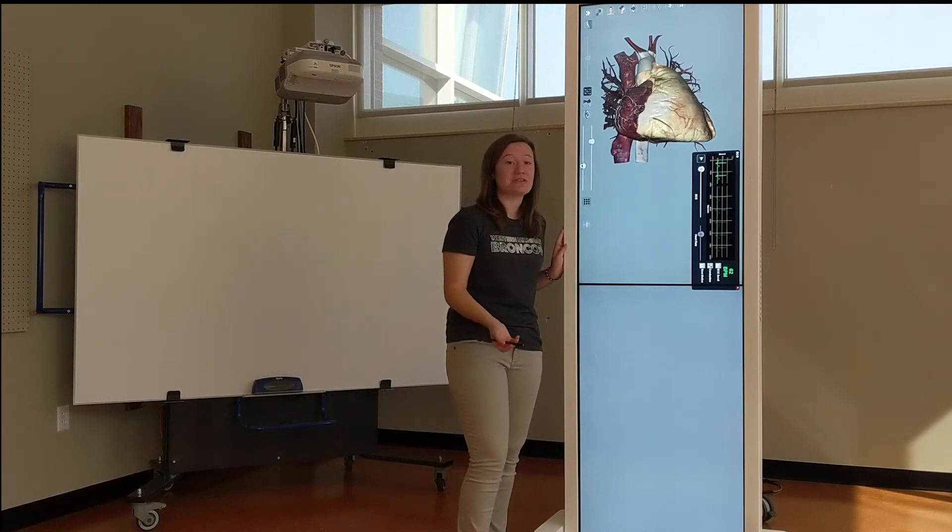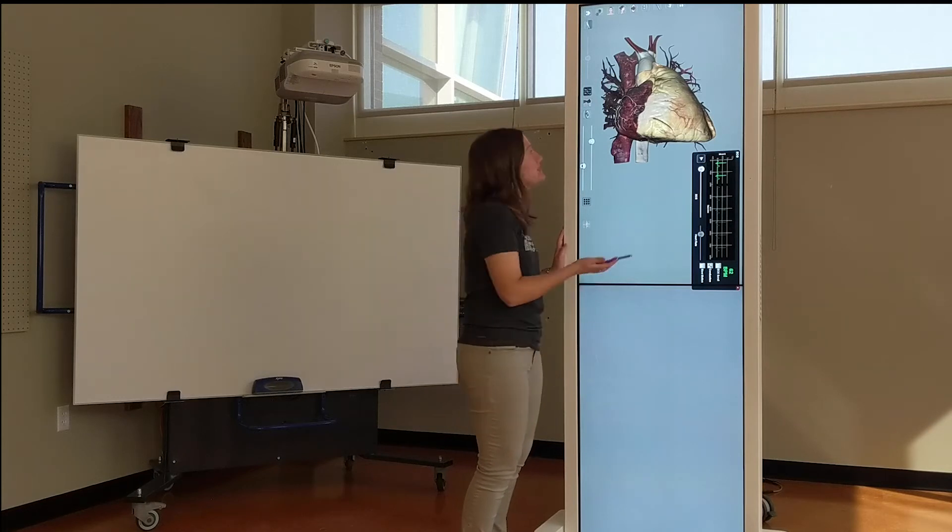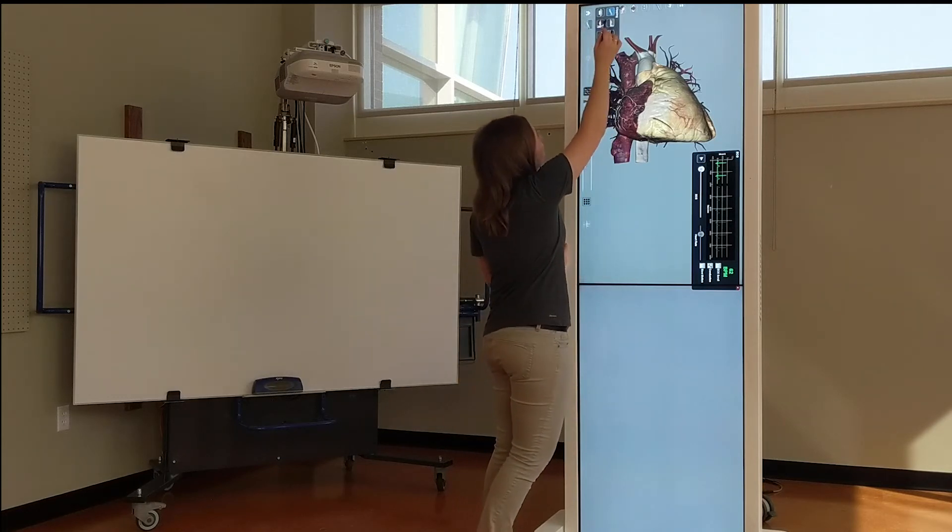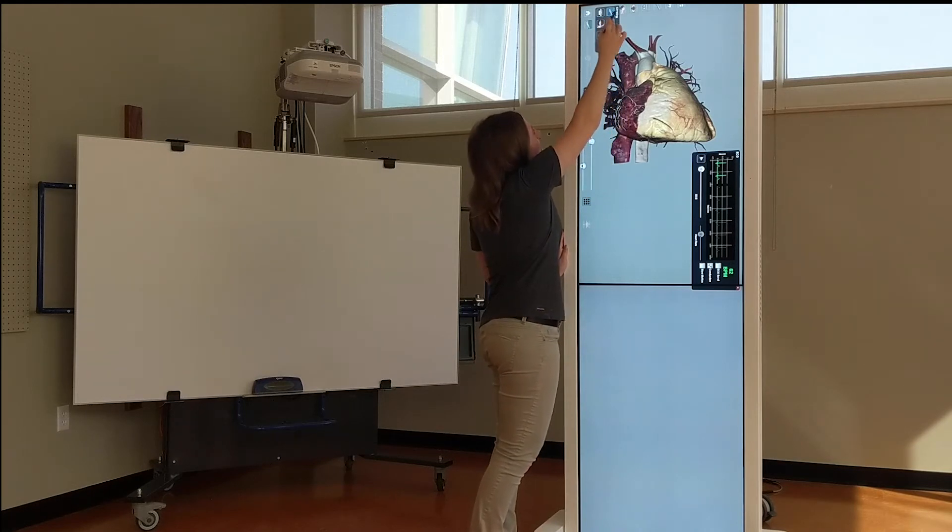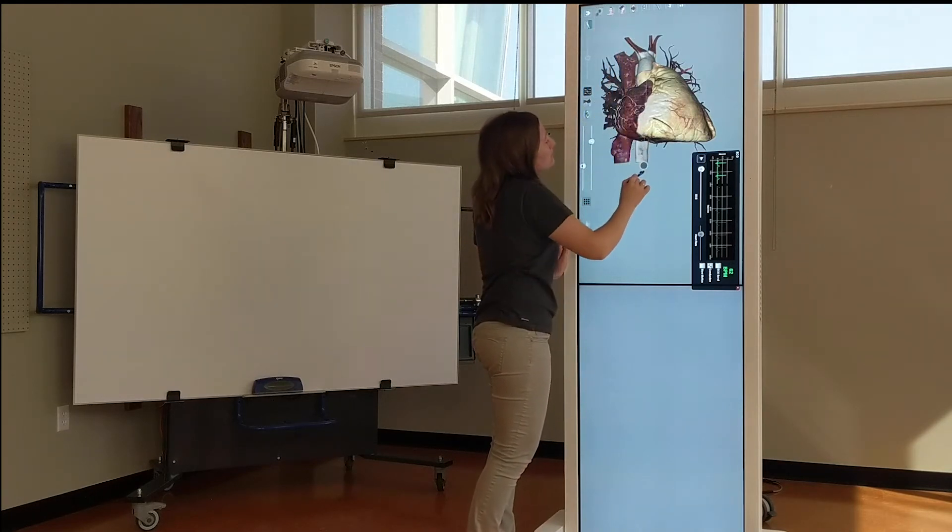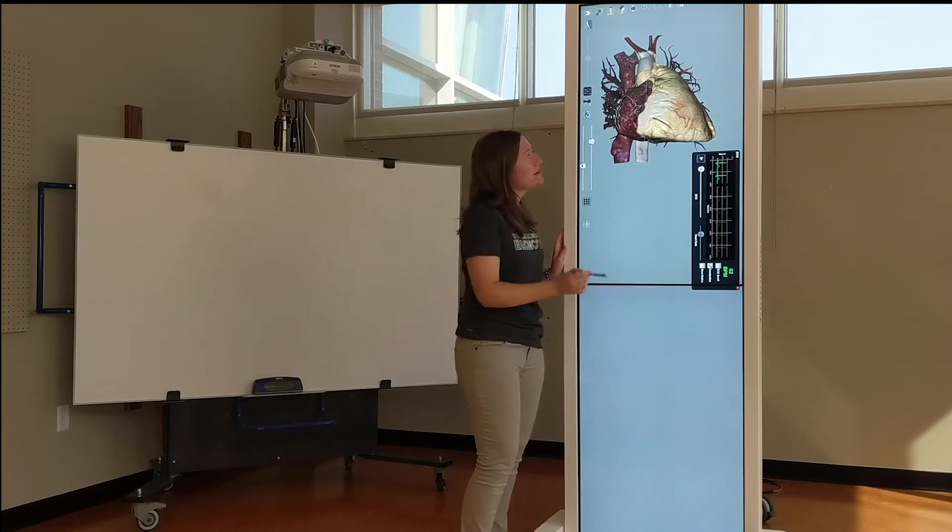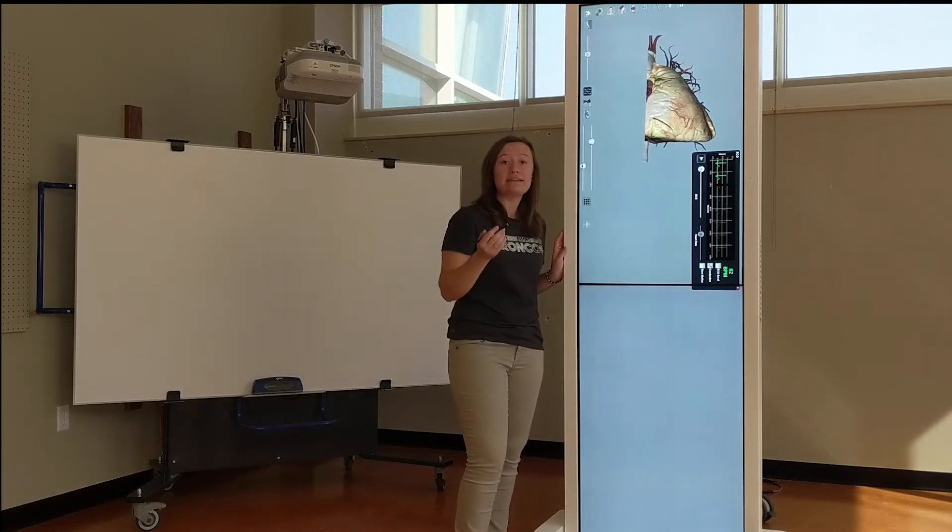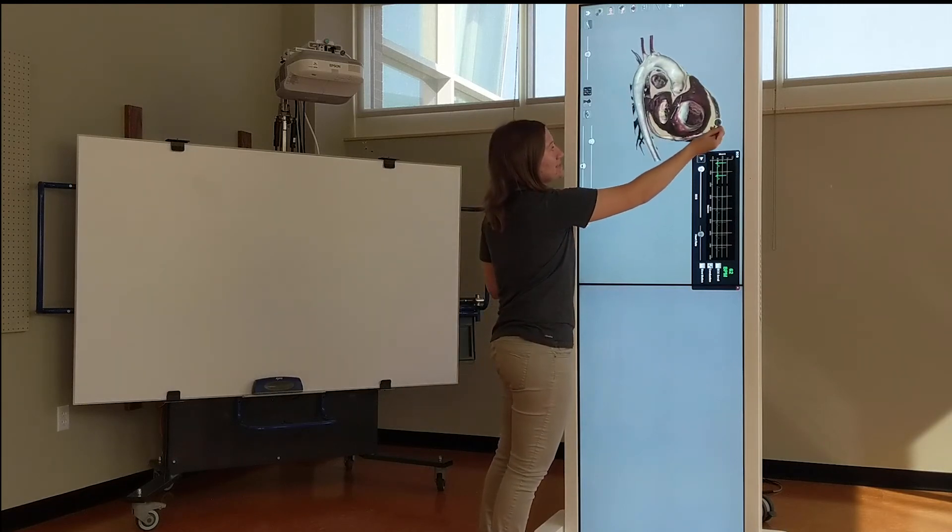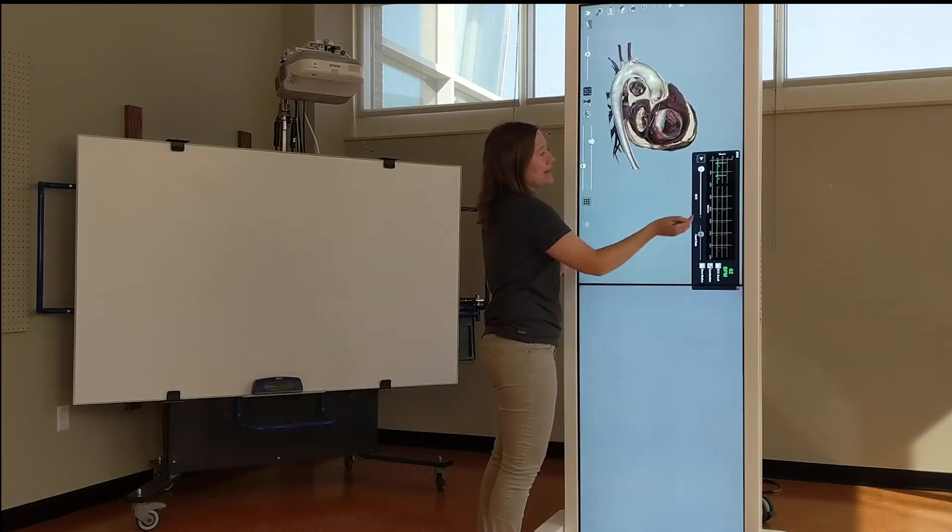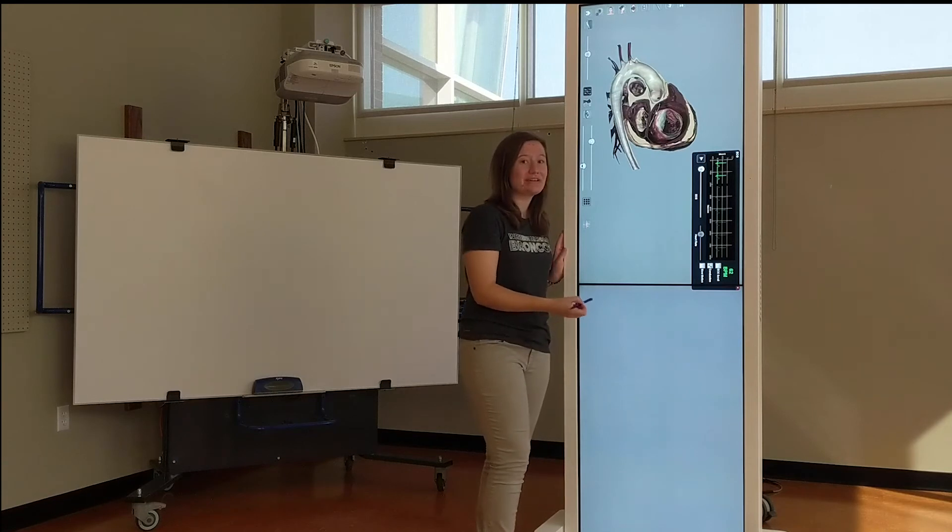One really cool feature of this table is you can dissect this heart to see what's going on inside while it's beating. As you can see here, I drew a line and that dissected half of it. Now I can twist it to see inside and I can even play the motion again.